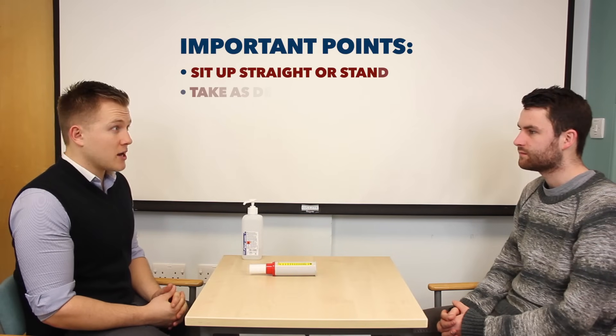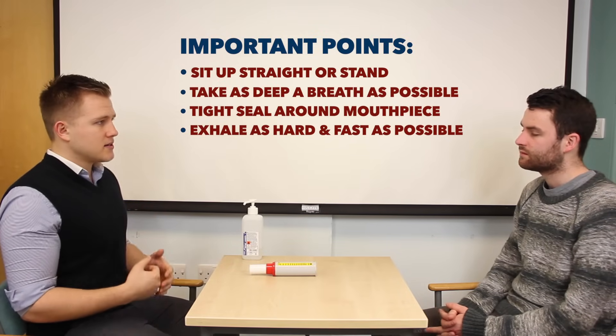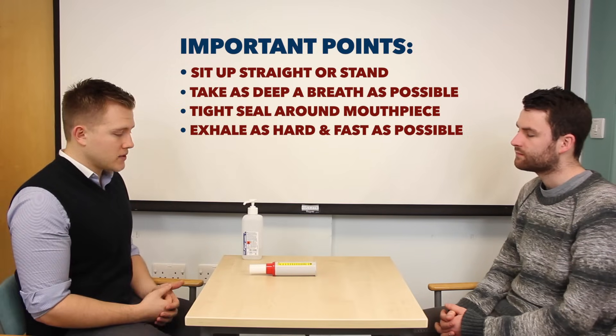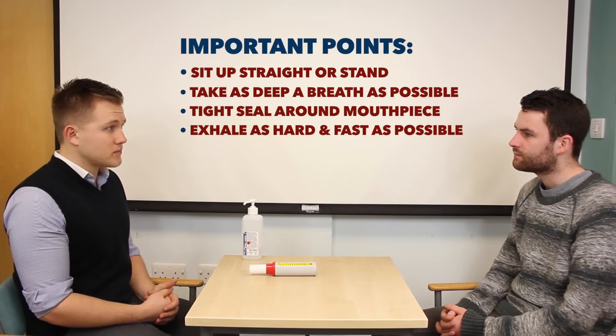Now that you've got your equipment set up Simon, there are some important aspects of the technique to remember. These are to ensure that you're sat up nice and straight, to take a nice deep breath in as far as you can, to ensure that your lips are sealed around the mouthpiece, and to breathe out as hard and as fast as you can.